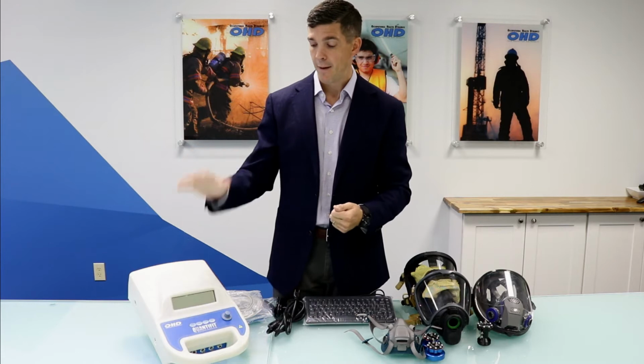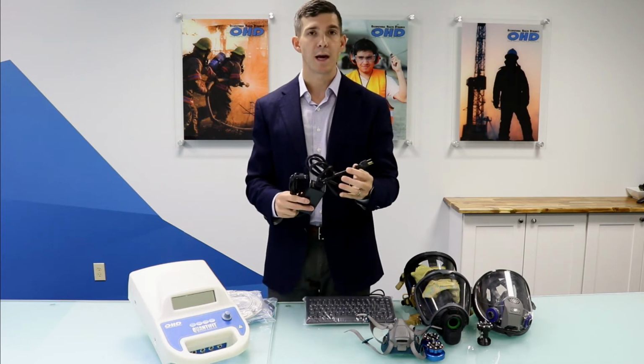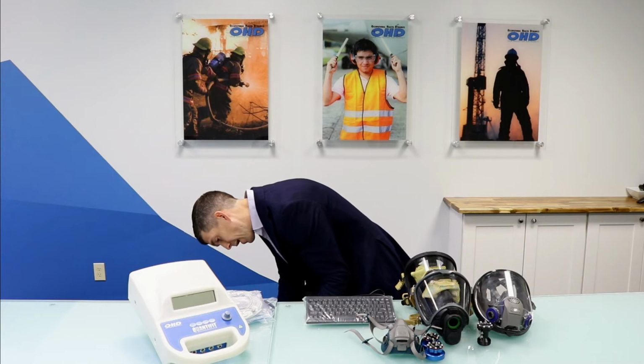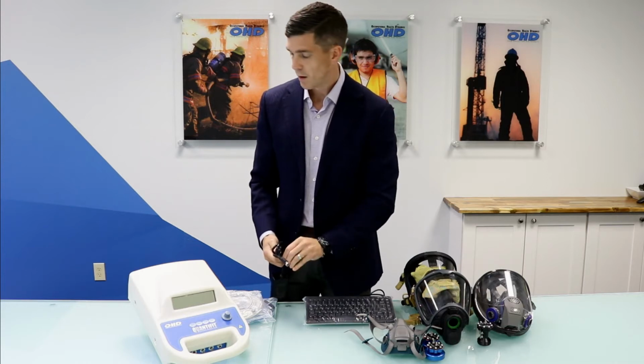You pull the unit out, and then the other components that we have, obviously standard power supply cable. This will come in the case as well. This plugs up to a wall outlet. I just so happen to have one here. And then what we'll do is plug this into the back of the instrument. And let me show you that really quickly because it's key.